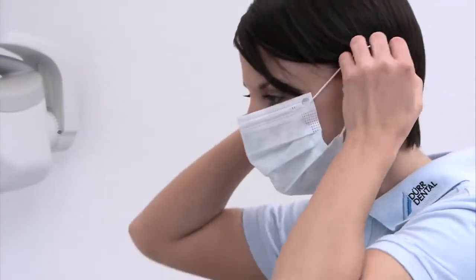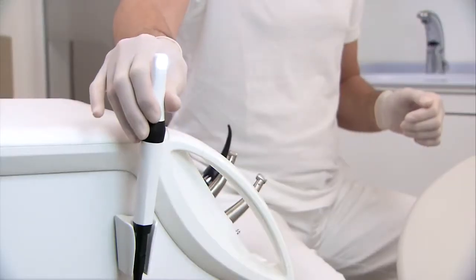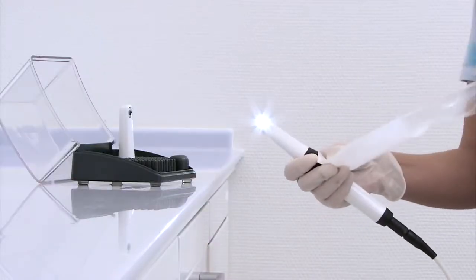The Vistacam iX combines intraoral and fluorescence imaging in a single camera and ensures the highest level of image quality and depth of field with full digital image transmission. The perfectly round, sophisticated positioning of the LEDs in the camera head ensures optimal even illumination.